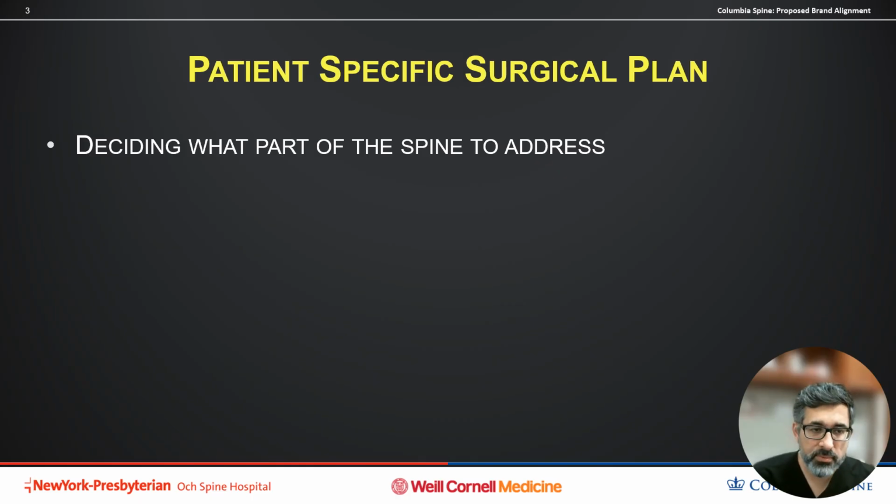So step number one for planning a patient-specific surgery is really to decide what part of the spine you're going to do the surgery on. And I'm going to show a couple of case examples to drive that point.